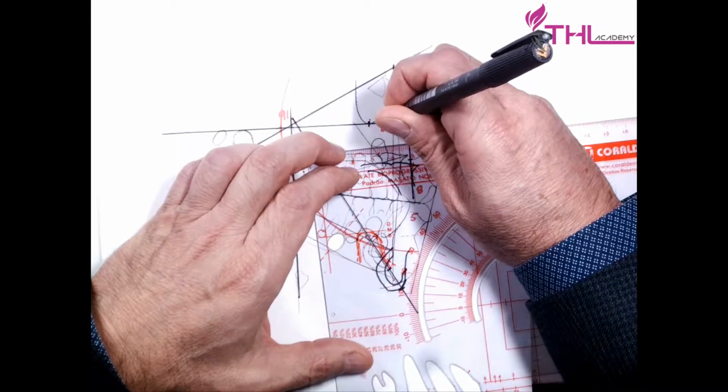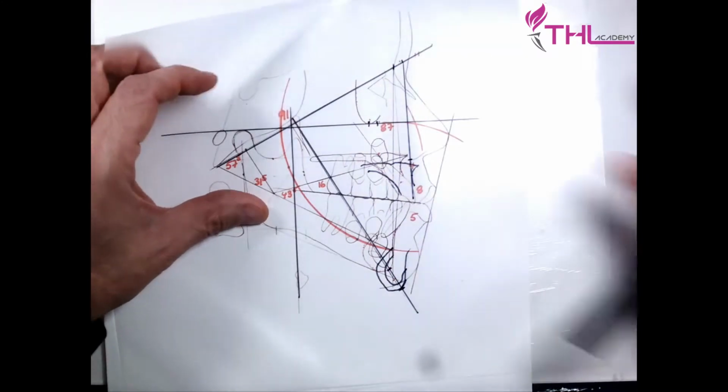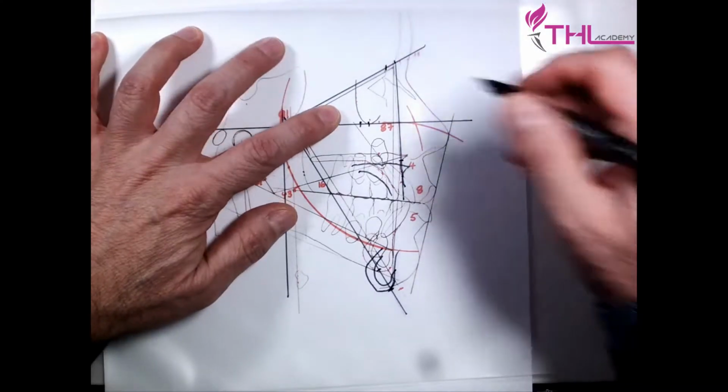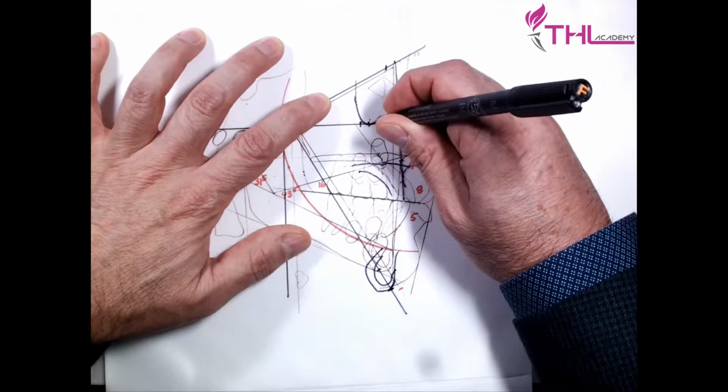So you put another point here, and then you go back and then you can draw the orbit.